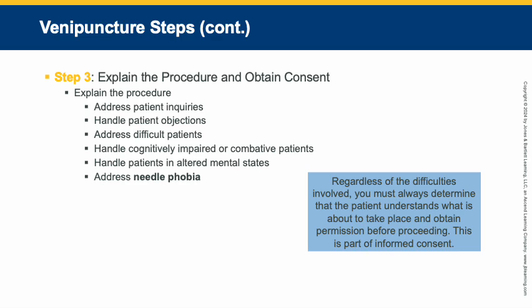Obtain consent, but do not go into detail explaining every aspect because they're already scared. They already know. Perform the draw quickly and efficiently. When it's over, keep the patient lying down until you are certain they are calm and not about to faint when they get up and leave.